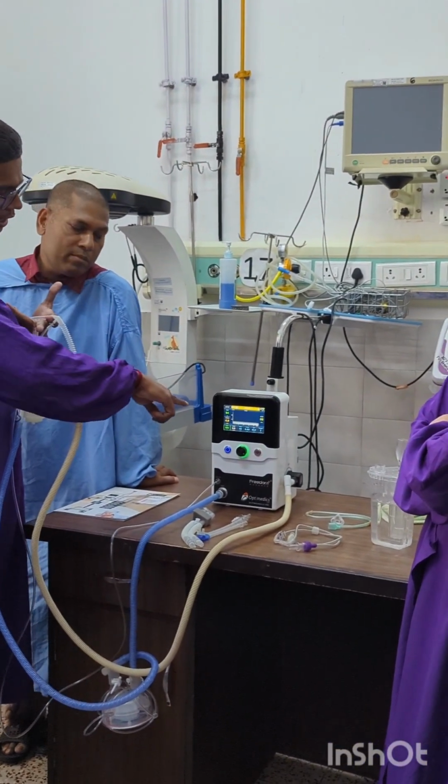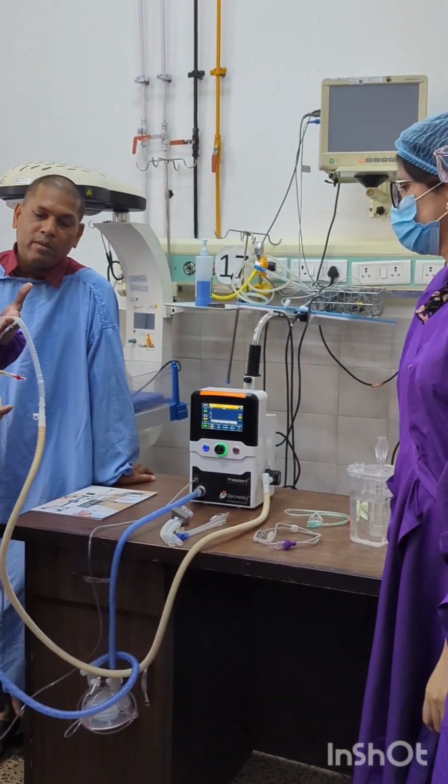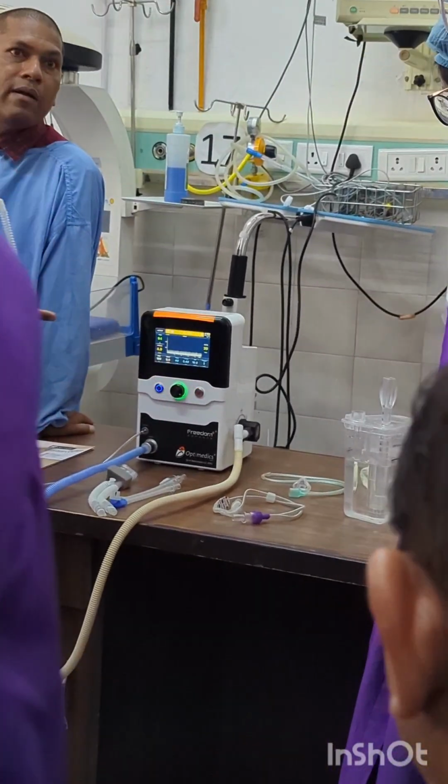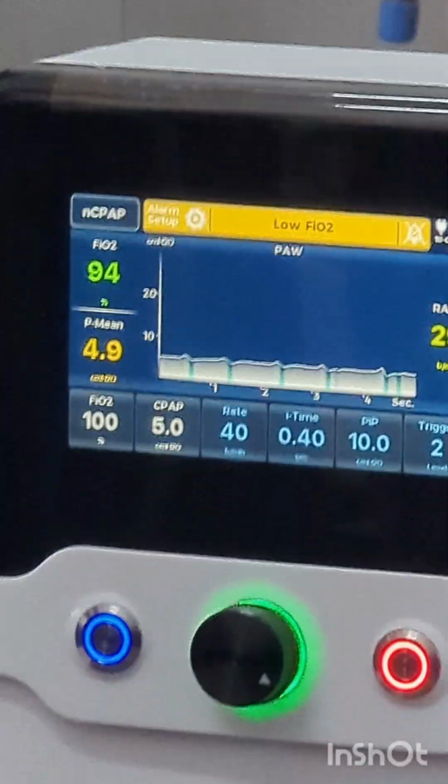One more thing we can add on this nCPAP is that if the baby is breathing spontaneously, each and every pressure drop is detected by the machine, and the machine can monitor the rate at which the baby is breathing. You can see.